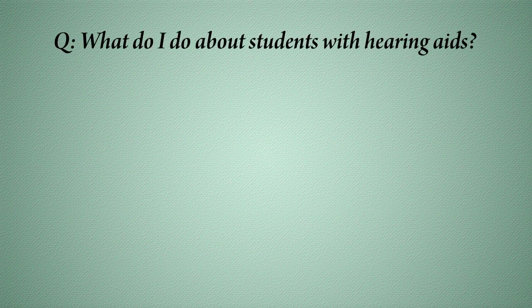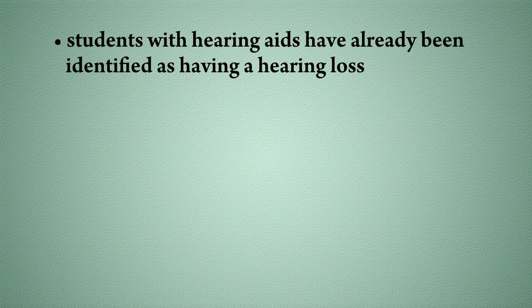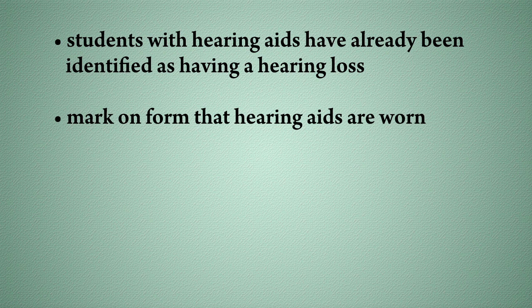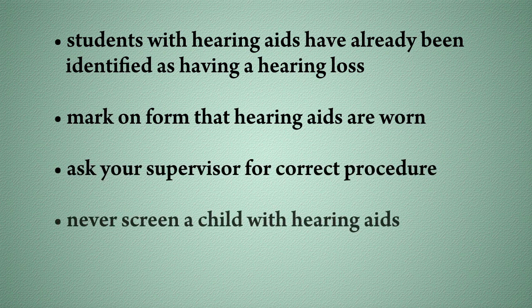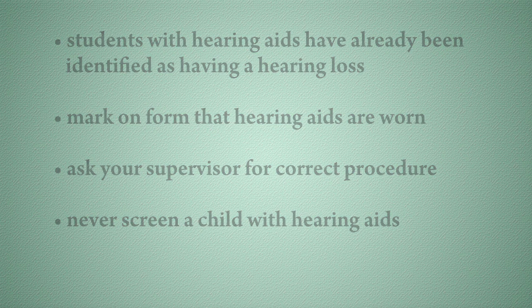What do I do about students with hearing aids? Students with hearing aids have already been identified as having a hearing loss and have received audiological management. If your report forms do not include a place to indicate that hearing aids are worn, find a place to write the information onto the form and ask your supervisor for the correct procedure. Never screen a child with hearing aids in the ears.